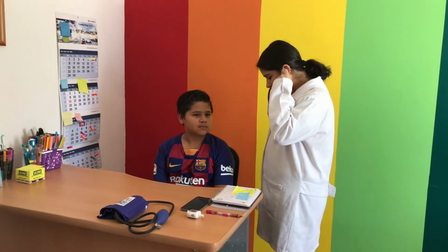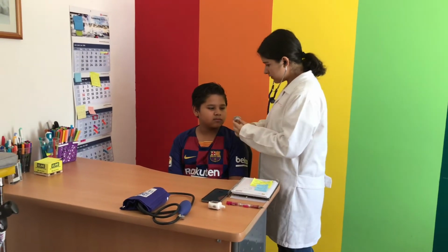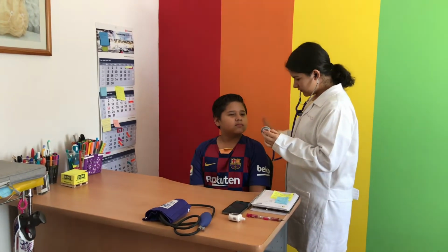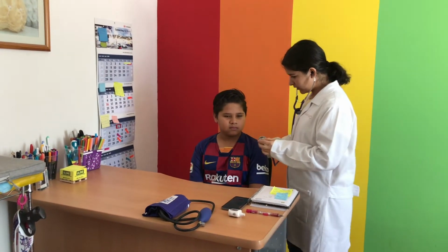So the third test we'll be running is the respiration rate. For this, I'm gonna use the stethoscope. Breathe in. Thank you.